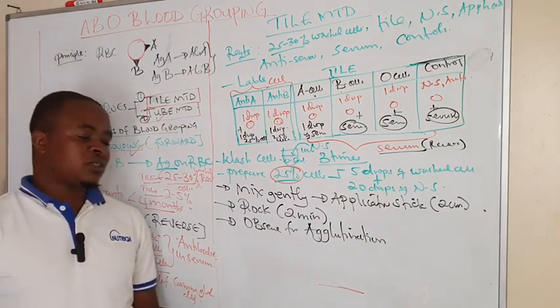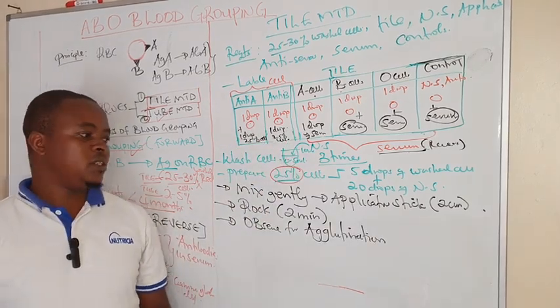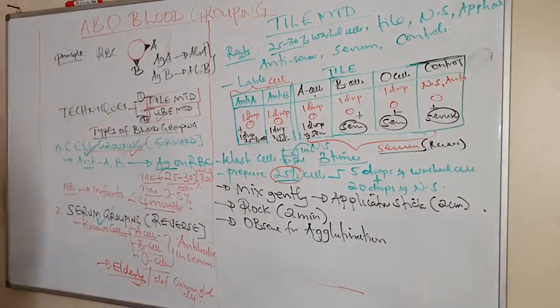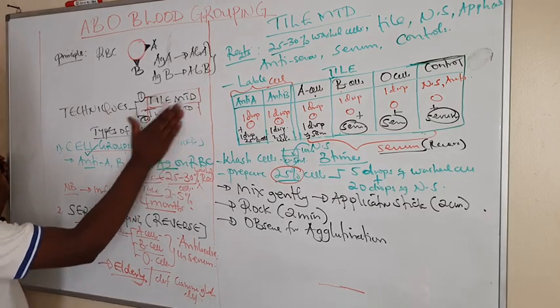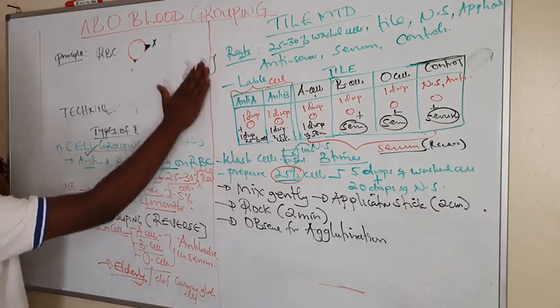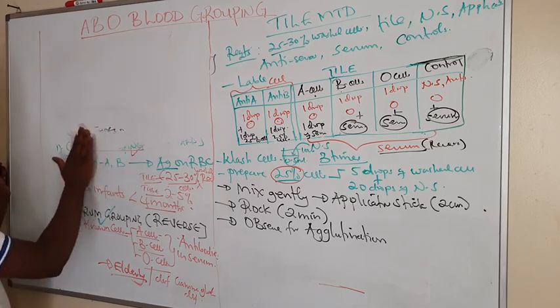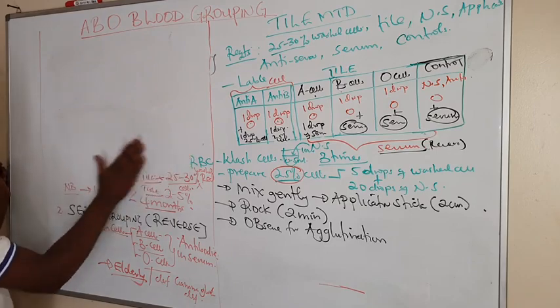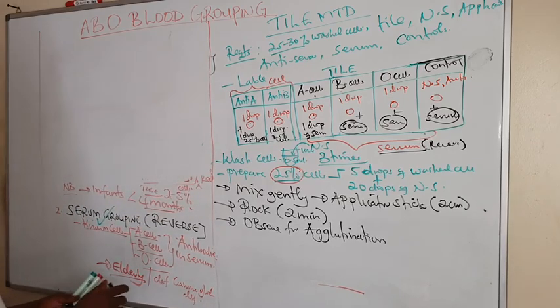Then you observe each partition as you record the findings. Maybe we're going to use this place for recording our findings. We can even use the same table.